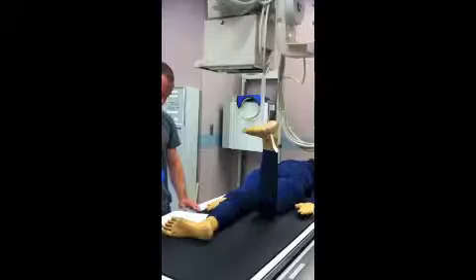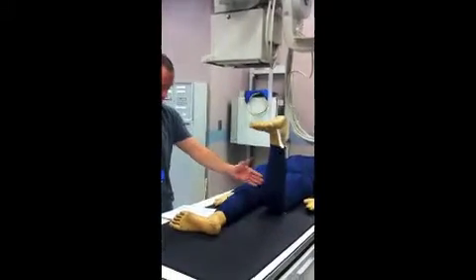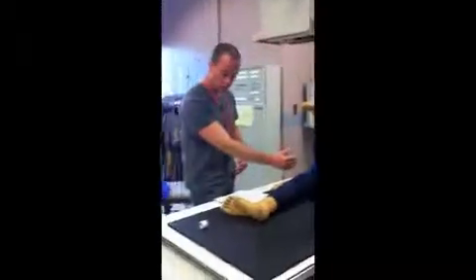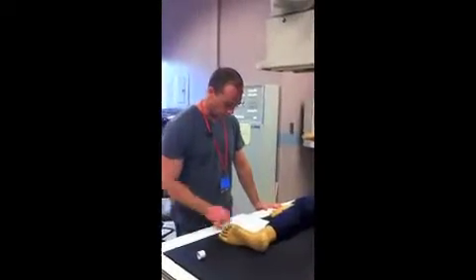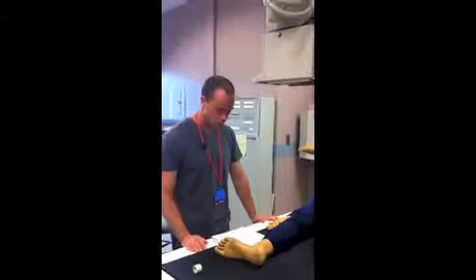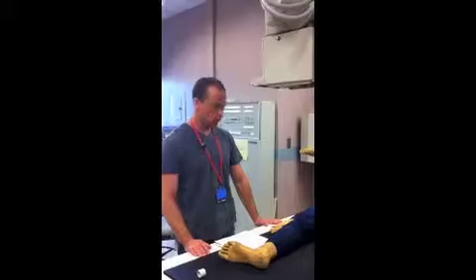The long axis of the leg you want to be vertical. And again, the IR is transverse under the knee, and you center it to the joint space between the patella and the femoral condyles.